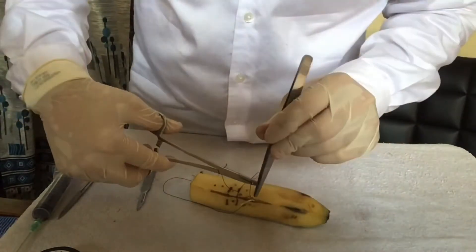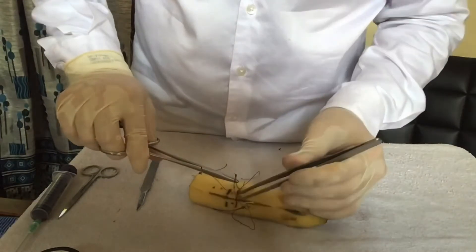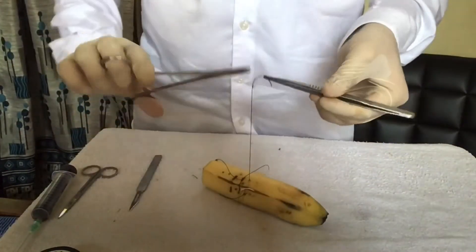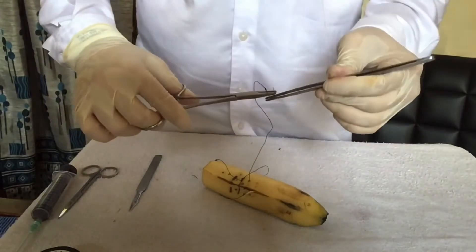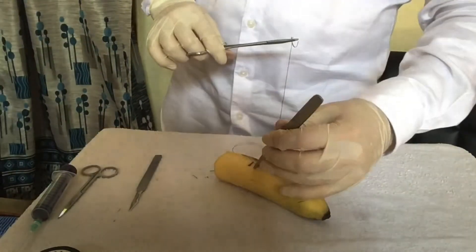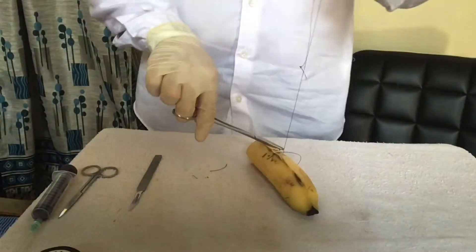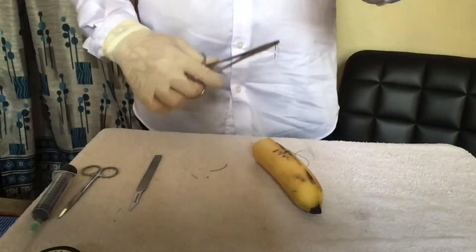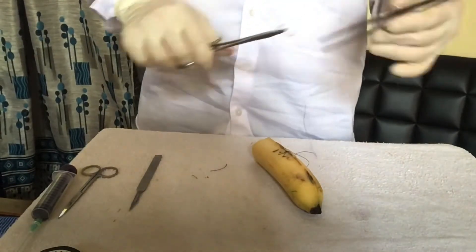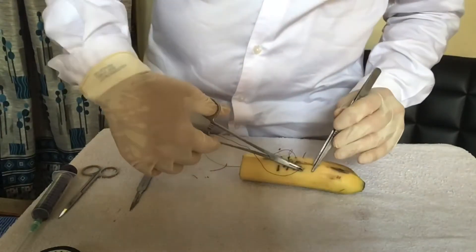Now perform the suturing in similar fashion but continuously without tying a knot. The depth of suture and the distance between two sutures on the skin are kept the same. For that, you can also use a marker prior to suturing at a particular distance so that the gap between the sutures remains the same.